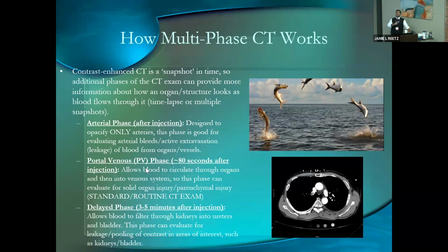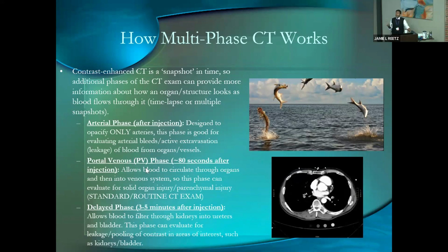Now, if you don't say anything to us at all, we'll give you one phase, but we'll give you a routine phase. We'll inject contrast, we'll wait 80 seconds, and then hit the button and tell the CT scanner, take pictures.